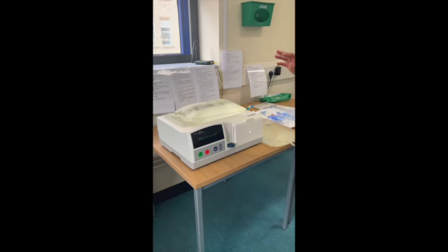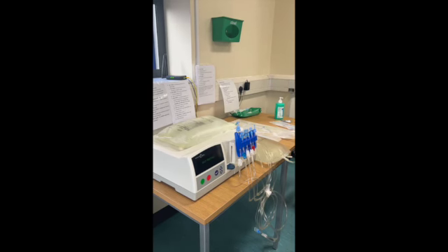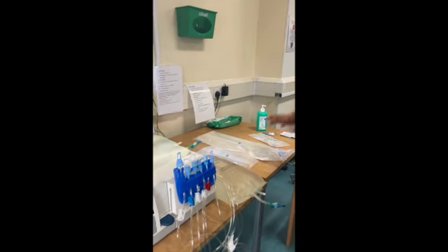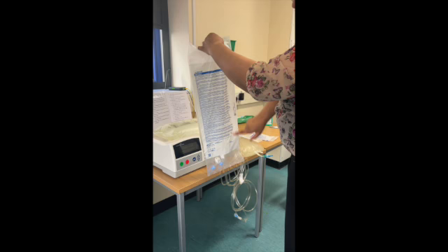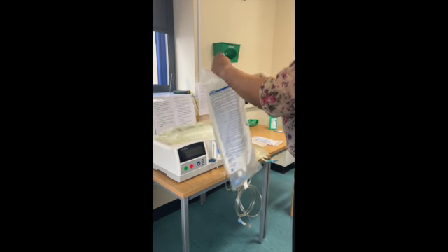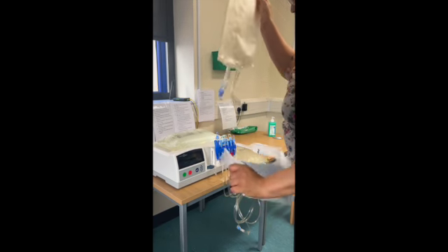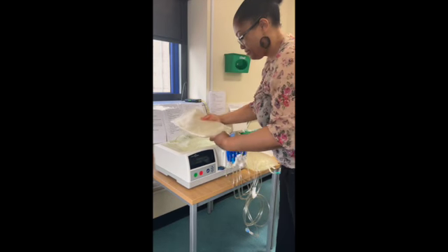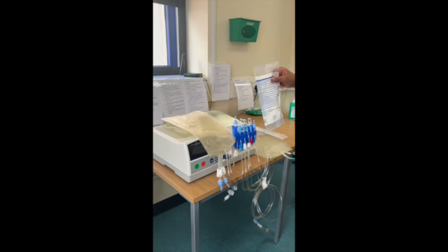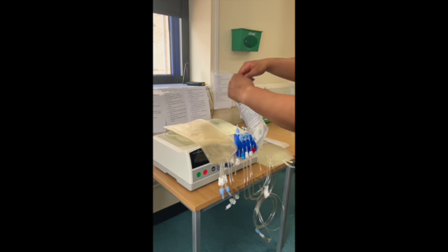So the next thing I have to do is press the green button. While the machine is self-testing, I'm going to connect the drain bag to the drain manifold. So to open the bag, there's a perforated edge here. Again, rubbish goes on the floor. So now I'm going to connect the drain bag to the drain manifold. Again, tearing down the perforated side.